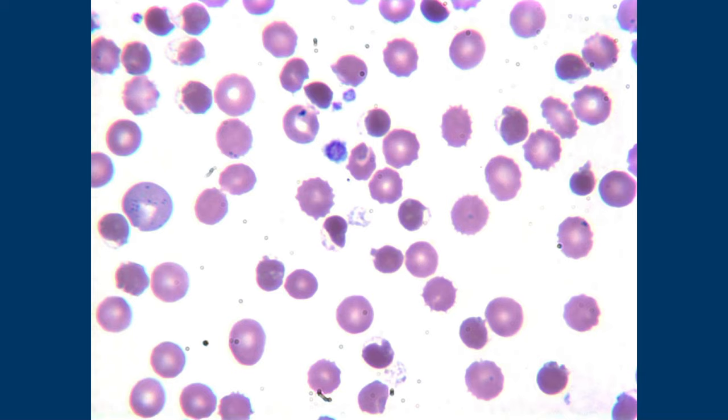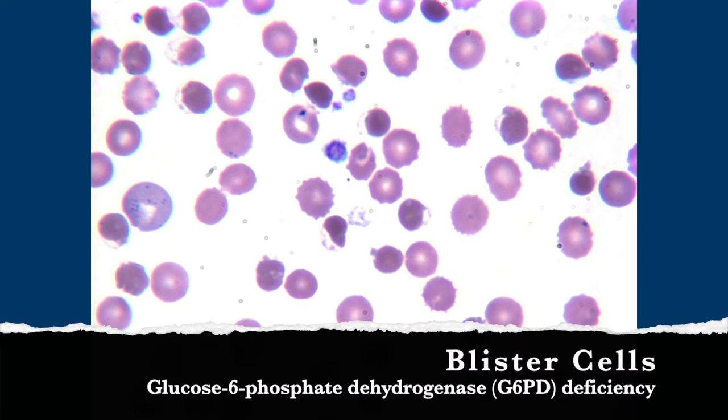This is a different red blood cell morphology. Some of these are echinocytes — little spiky guys — partly because this slide had been sitting. But your eyes should really go to these blister cells — they've got a little clear bleb coming out one end. Blister cells should make you check your patient for G6PD deficiency, though they're not specific. This red cell also has a little basophilic stippling. You can also see that one red cell is a little more purple than its neighbors — that's polychromasia. If you stained it with a supravital stain you could call it a reticulocyte, but without that special stain we say polychromasia.